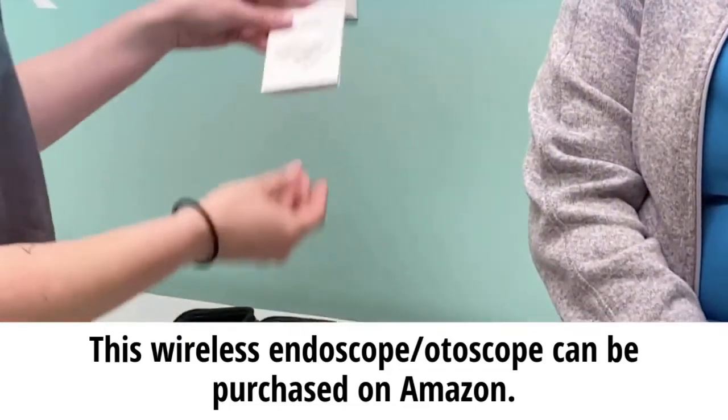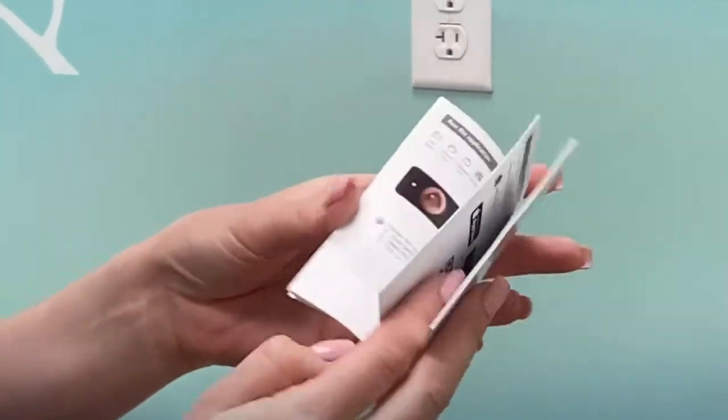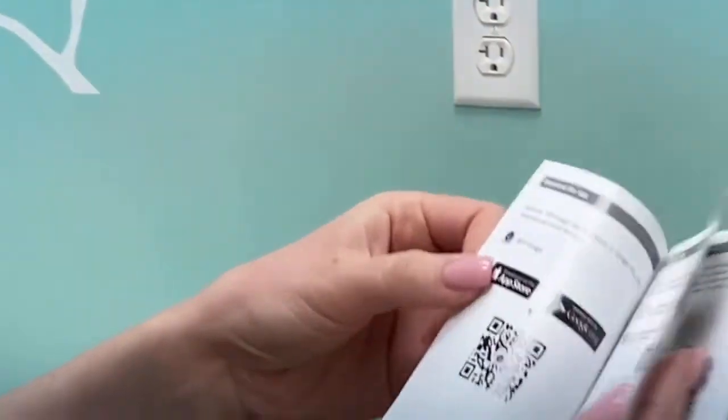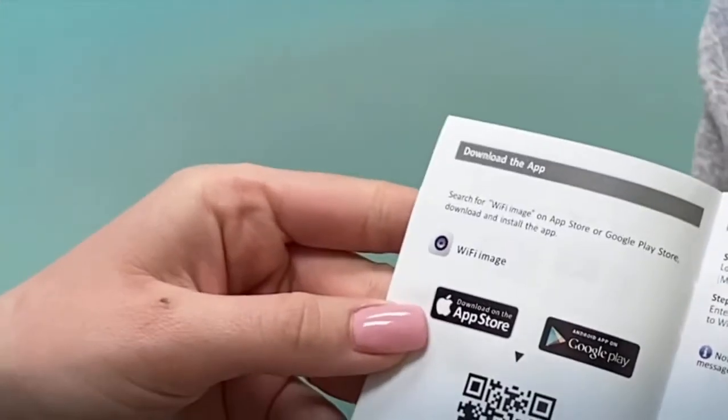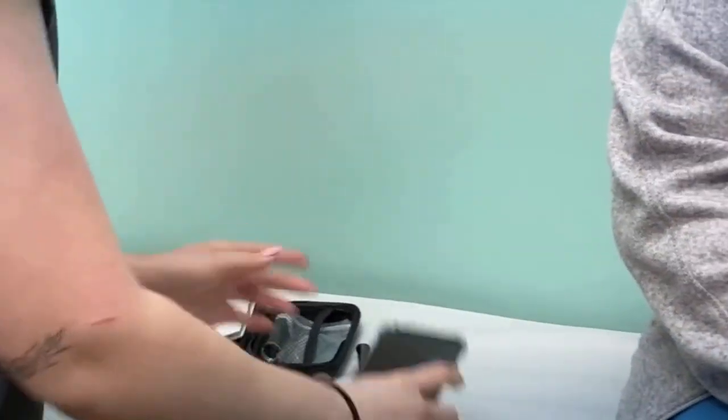Our first step is to look at our user manual and we're going to flip open to see which app we'll be using for this. Right here — Wi-Fi image. That's the app that we'll be using, so we're going to head over to our app store and download that real quick.